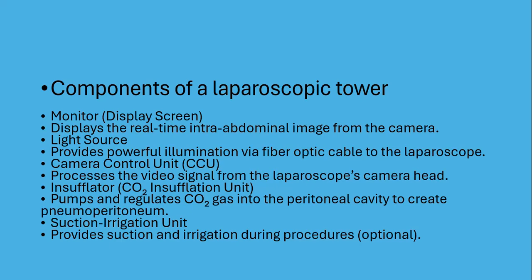Monitor, display screen: displays the real-time intra-abdominal image from the camera. Light source: provides powerful illumination via fiber optic cable to the laparoscope. Camera control unit, CCU: processes the video signal from the laparoscope's camera head.